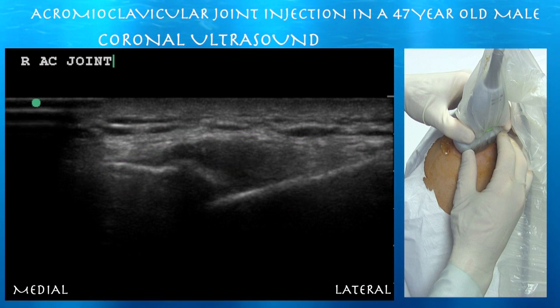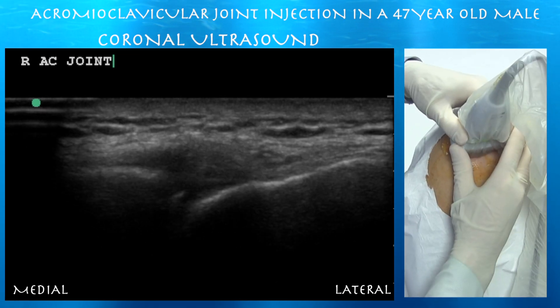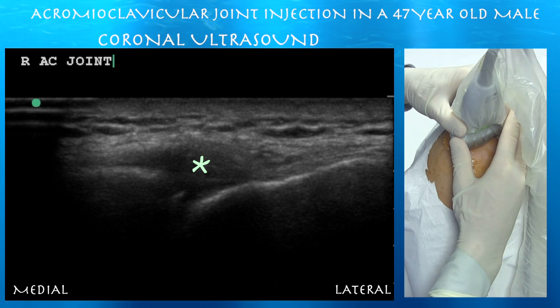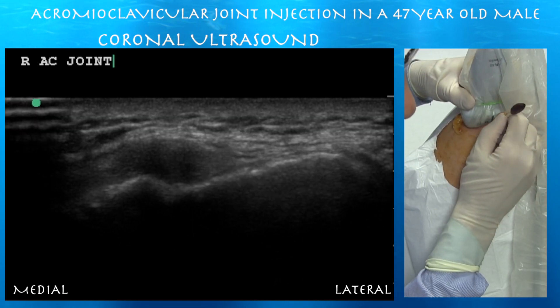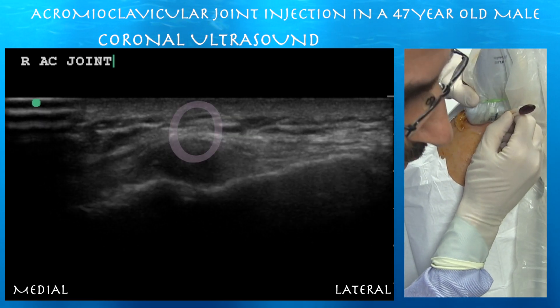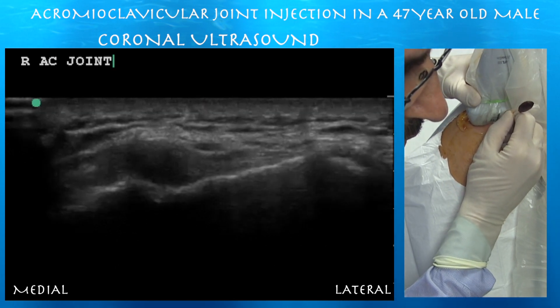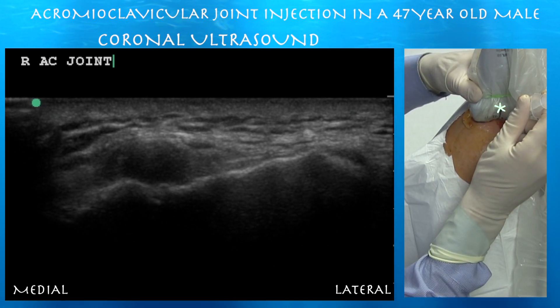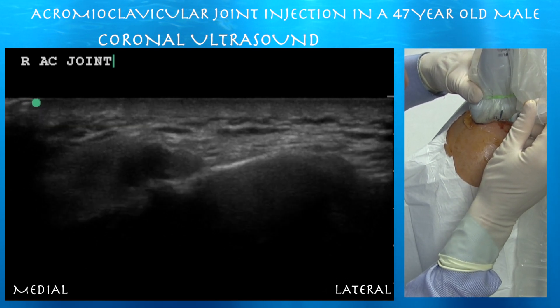That space created by the tenting of the capsule is going to be your target. What we're going to do is basically just get the injection above it and it'll just trickle down. We're centering the target on the screen, marking where we're putting pressure with the swab. You basically want to get your target in the center of the screen, line it up with the marking on the probe, then put your needle right underneath the probe, and hopefully that will get right into the target.